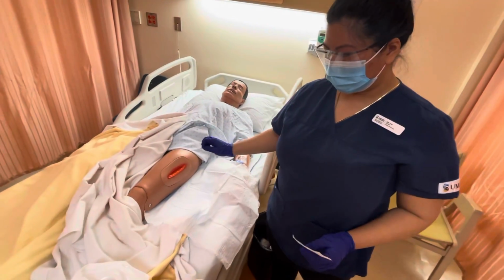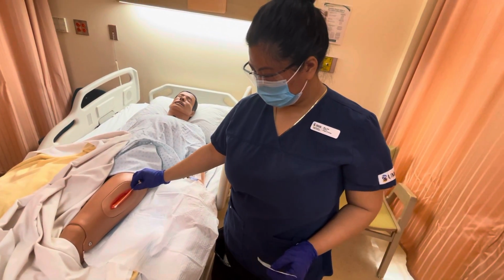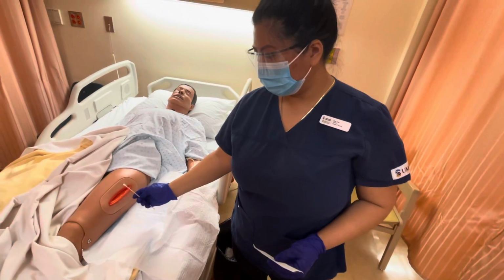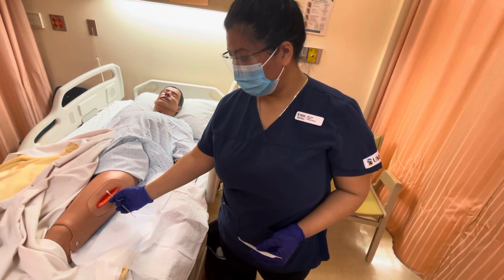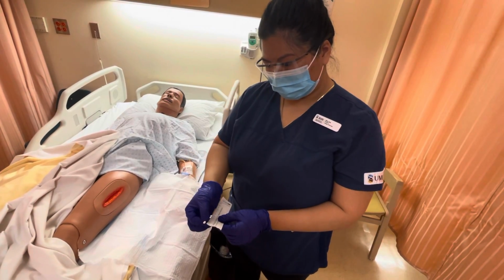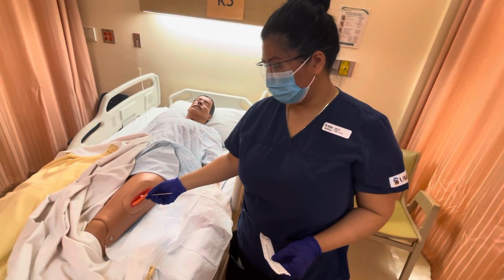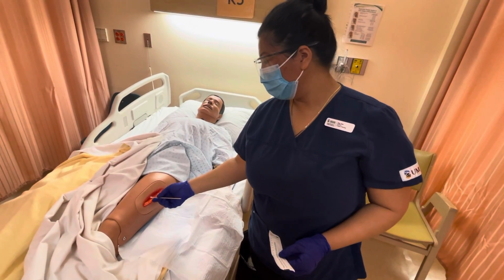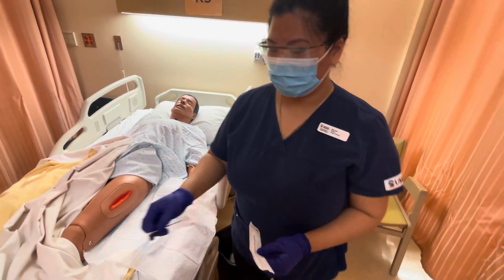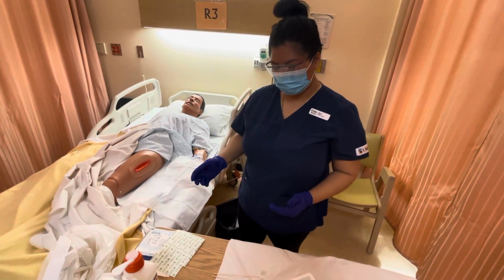So we're going to measure the length of the wound. That is about 11 centimeters, and then the width is the widest part. That is about 2.5 centimeters, and then we want to measure from the deepest part of the wound bed for the depth. That is about 1 centimeter. So this will just go into the garbage, and then now we're ready to pack our patient's wound.